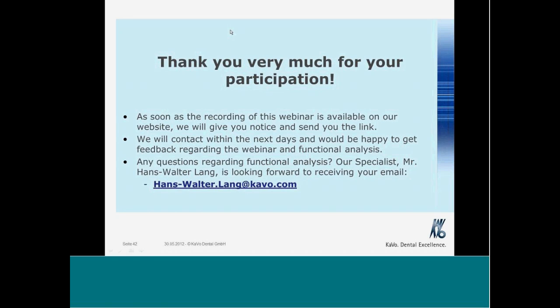What we always have to have in mind is that this centric position is, let's say, on a daily basis. We have a physiological position for today with this patient. When you do a new registration, let's say in 2 or 3 or 5 years, you will find another physiological centric position.